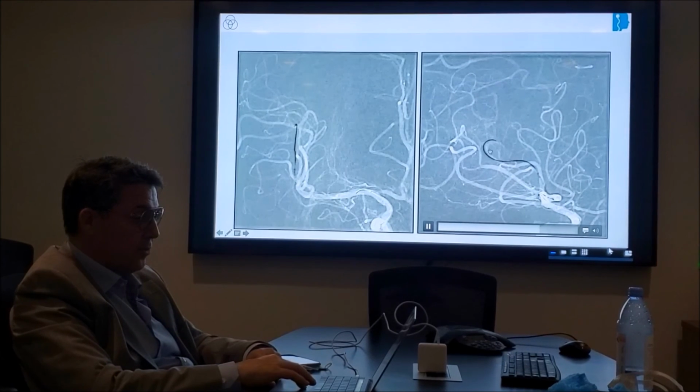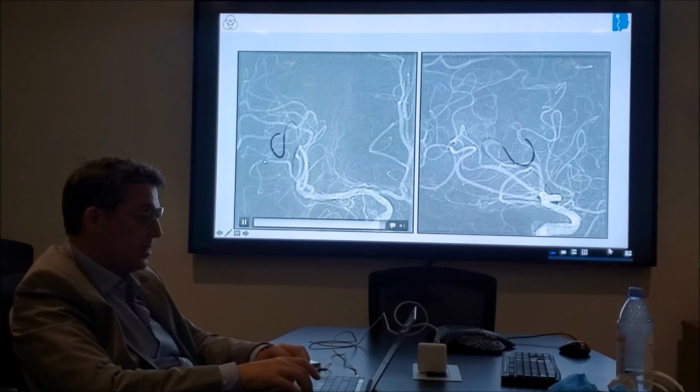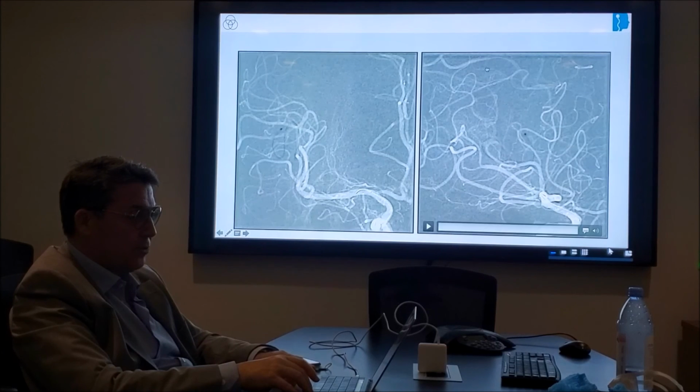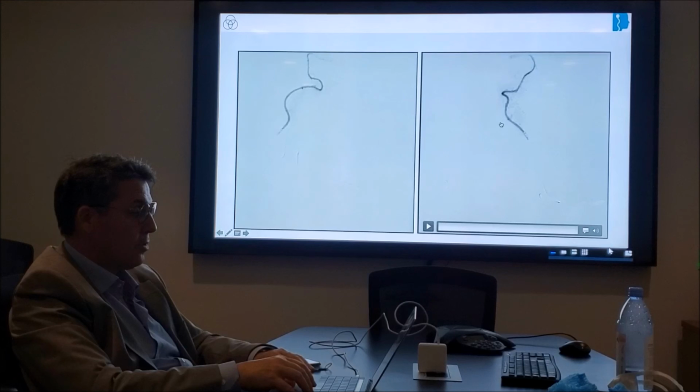Now the catheter is following, and now we're in the occluded segment down the Sylvian point. And once the wire is in, you see you can push it, but of course this patient is under general anesthesia, it's not moving, so you can see where you are, and this is an artery going somewhere close to central sulcus. Now we're beyond the clot, but I don't know where the clot stops.